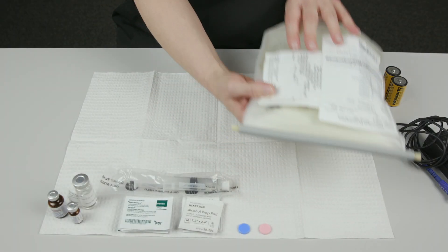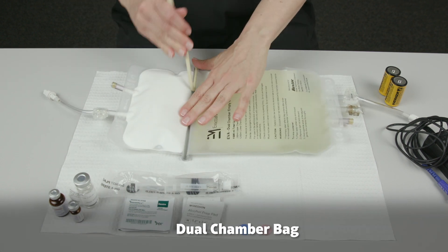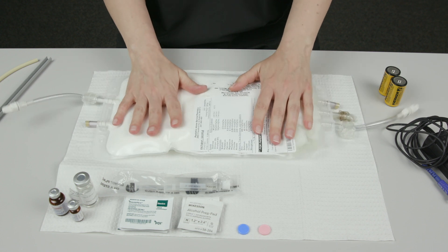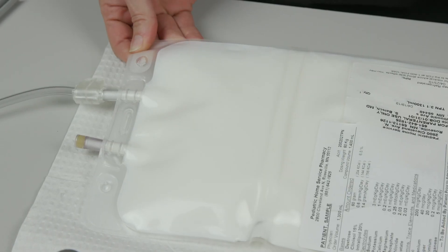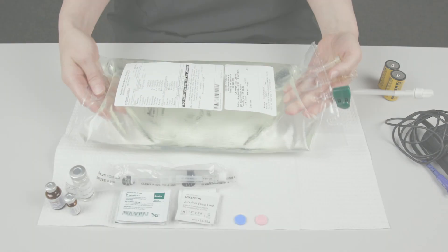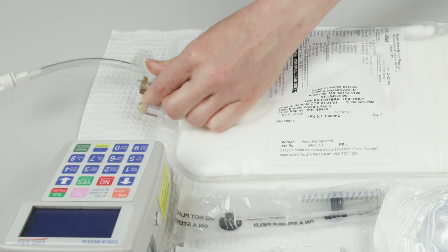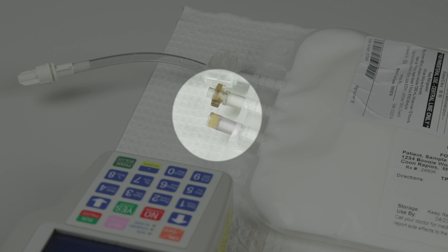If you're using a dual chamber HPN bag, pull the flexible cord completely out of the plastic holder. Turn the bag over and pull the plastic holder away from the bag. Whether you're using a dual or single chamber bag, gently rock the bag until all contents are mixed together and there are no streaks or oily layers in the fluid. Remove the tab on the HPN bag's tubing port. Lay the bag on the safe zone, making sure the tubing port does not touch the surface.